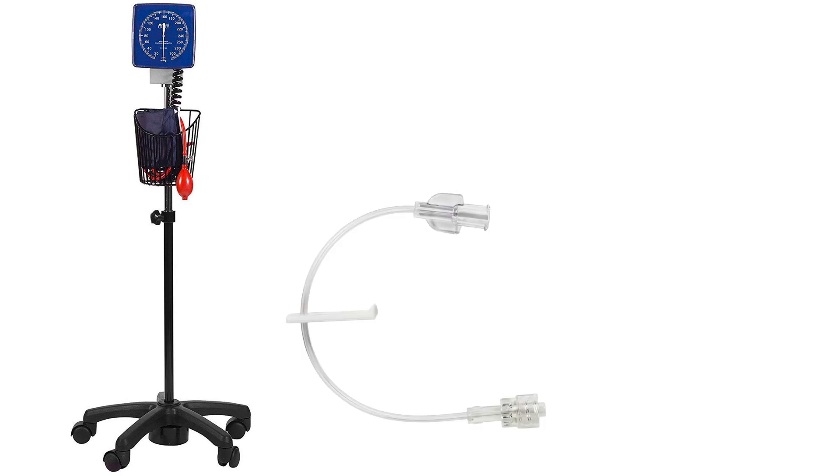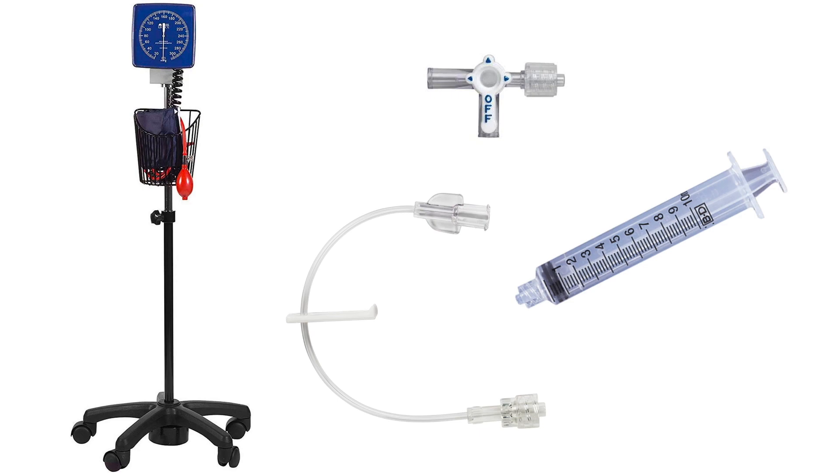But what if you don't have access to either of those? Here's a do-it-yourself solution with more common equipment. Here's what you'll need: a blood pressure gauge, IV extension tubing, a three-way stopcock, and a 10 cc syringe.